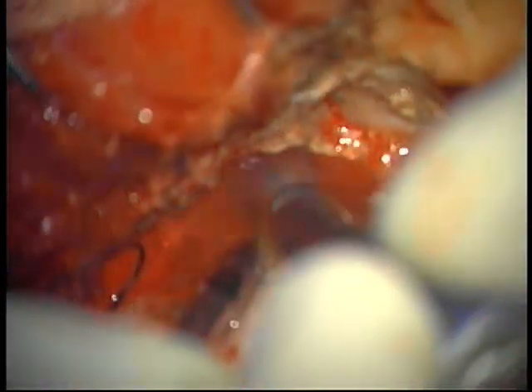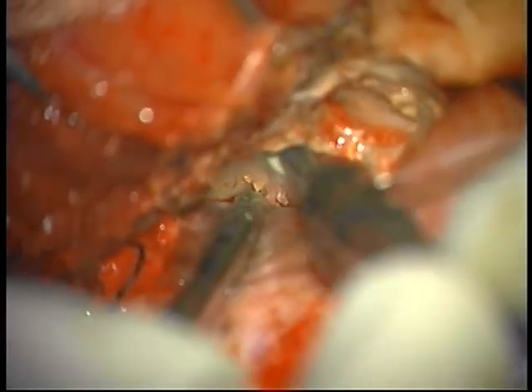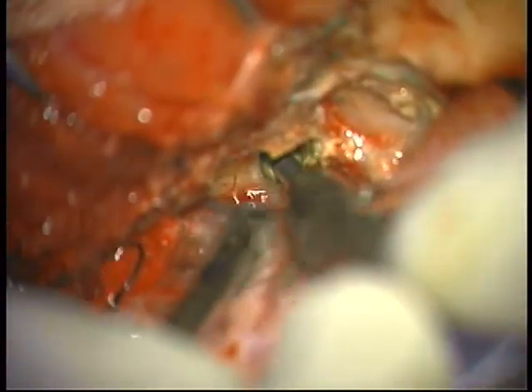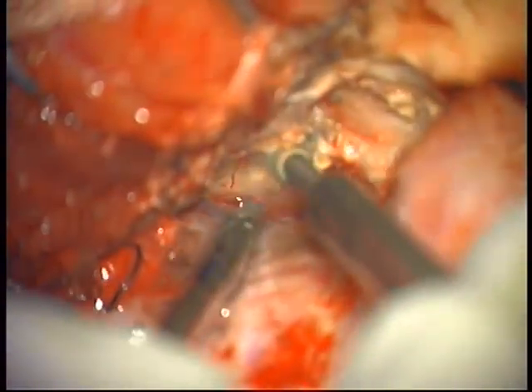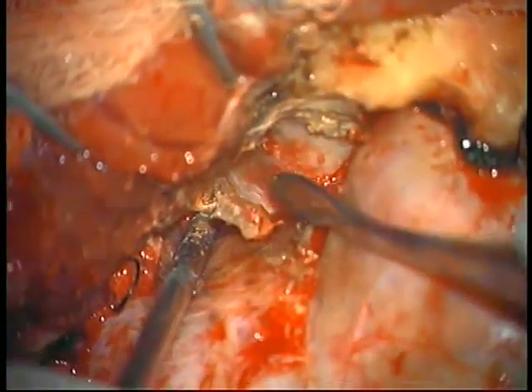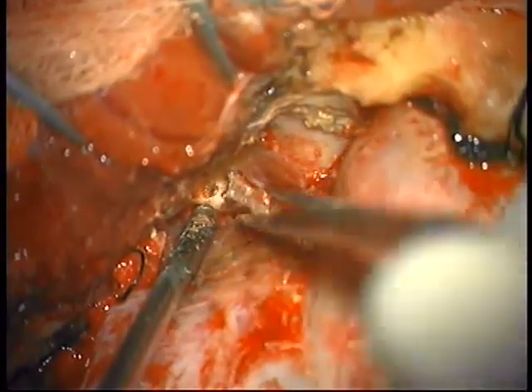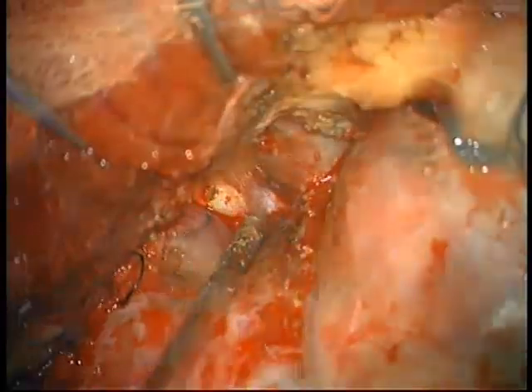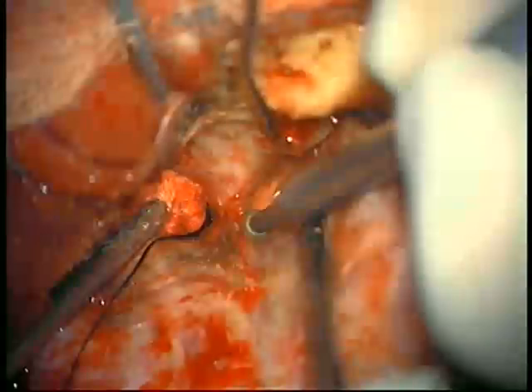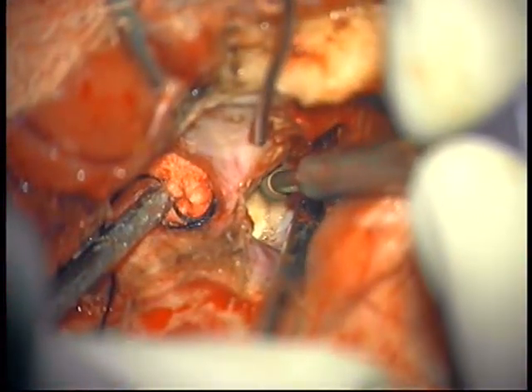At this point, we move laterally to identify the foramen rotundum and make a drilling between the foramen rotundum and the apex of the orbit. In this way, the lateral wall of the superior orbital fissure is obtained in one piece. In this case, we drill the roof of the optic nerve until the nerve is totally exposed extradurally.